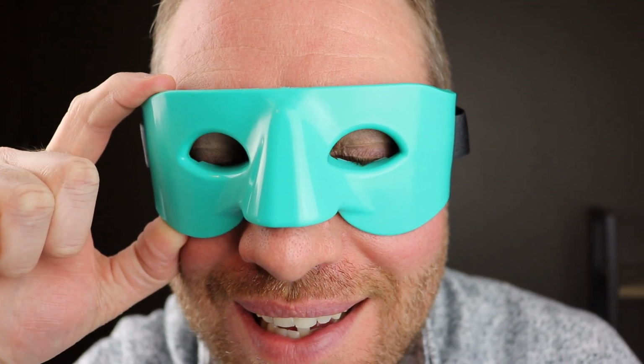That blinking action, that blinking mechanism actually allows you to secrete the oil out of your oil glands. And so while you're doing the warm compress and blinking to help secrete that oil is a double benefit. And so this is another big pro to this type of design, this type of warm compress. Now just like with any product, there are a few cons that we do need to mention.